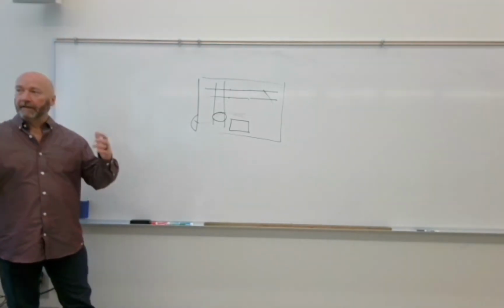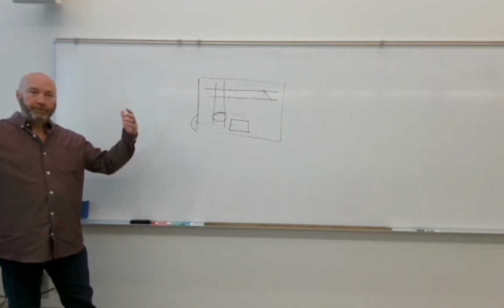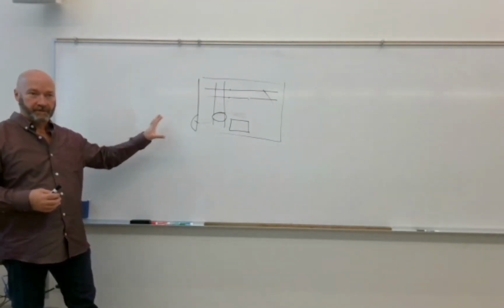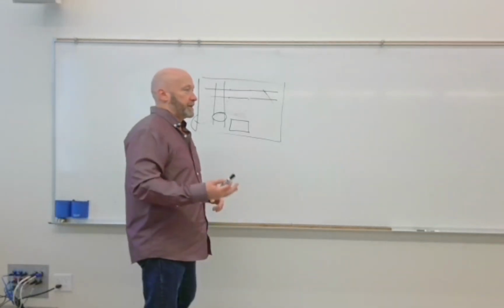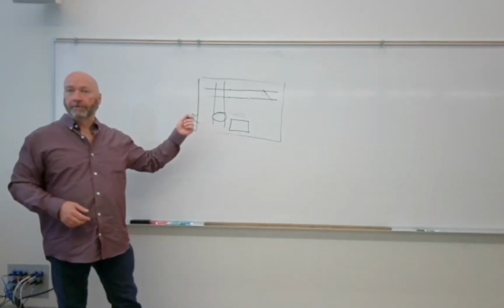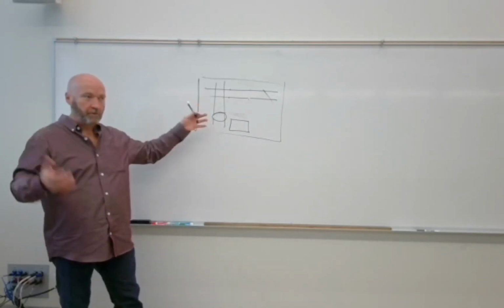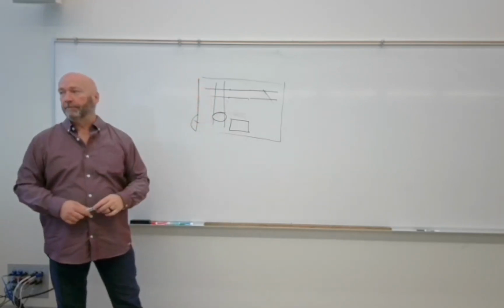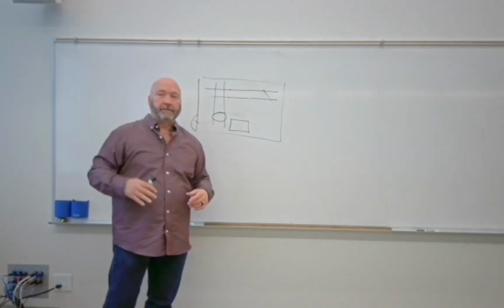Most flexible ceiling mounted systems. Okay. But because of all that superstructure that you have to have, they're very expensive to create. And these typically tend to be your higher end X-ray units. So, doctors make a lot of money, but $250,000 worth of X-ray room, $250,000 worth of support system to hold the X-ray room up, plus a building tall enough to support all that stuff, it's just not feasible for most doctors.